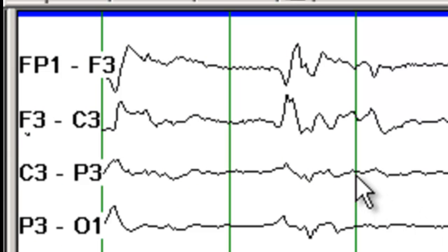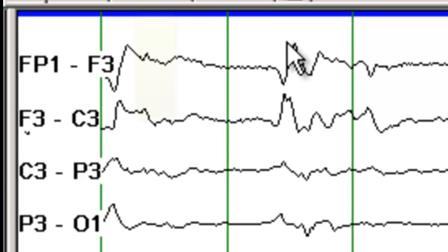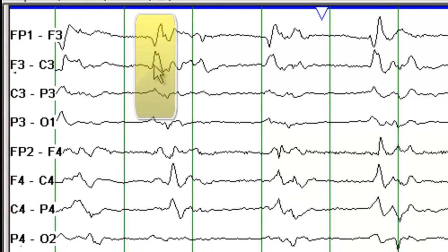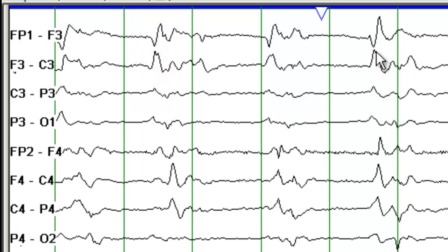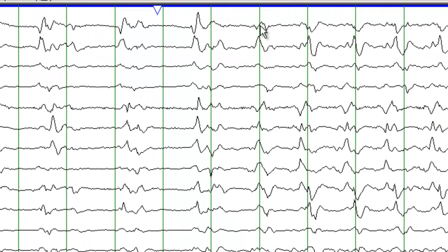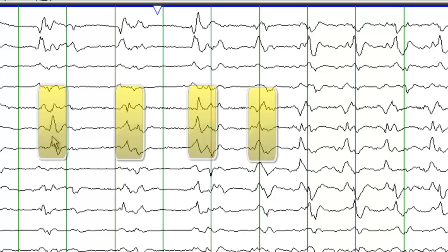Instead what you see here, you see these sharp waves, somewhat biphasic or triphasic sharp waves that occur after somewhat of a regular interval. So you see these sharp waves occurring on the left side and likewise you see the sharp waves occurring on the right side.